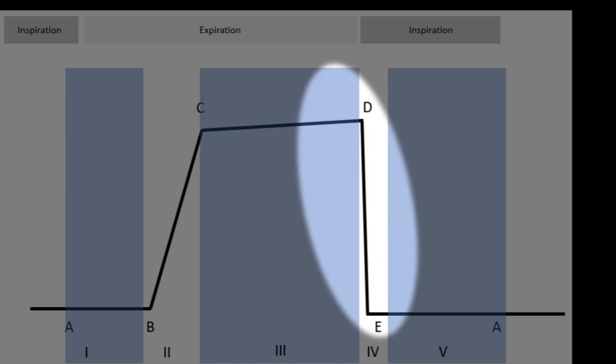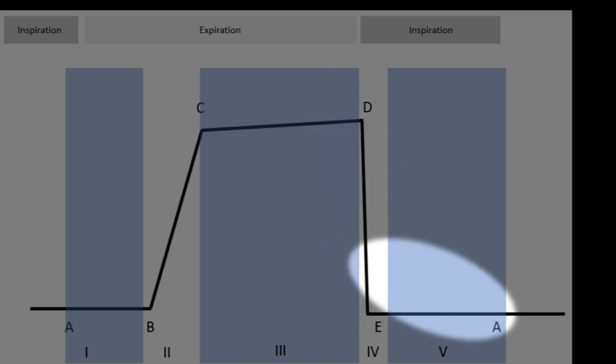Phase four, D to E. This is the beginning of the next breath, and the CO2 is returning rapidly to zero. Phase five, E to A. During inspiration, the CO2 value is normally zero, so we return to the baseline.